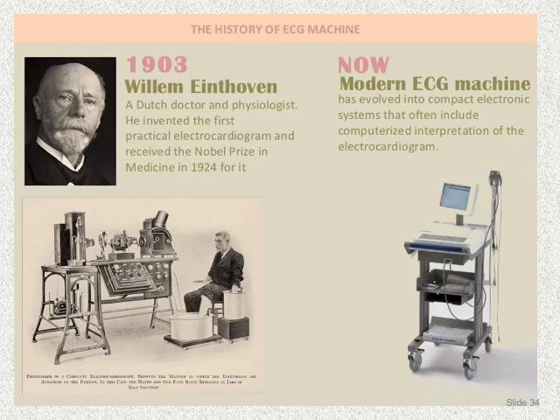But because the ECG is widely available and is inexpensive and very effective, I think every physician, including primary health physician, should know the broad diagnosis. That's why we are teaching ECG for medical students. As we will see in our example, this will be life-saving, and we don't have time to refer to a cardiologist to interpret the ECG. So each doctor should have a basic knowledge of the ECG.